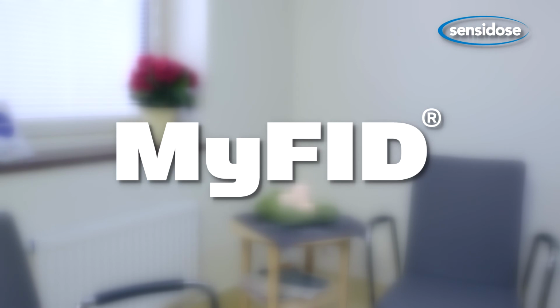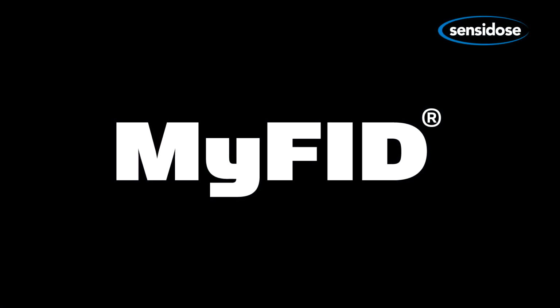This was a tutorial for the SensiDose dosing device named MyFID. MyFID stands for My Flexible Individual Dosage.